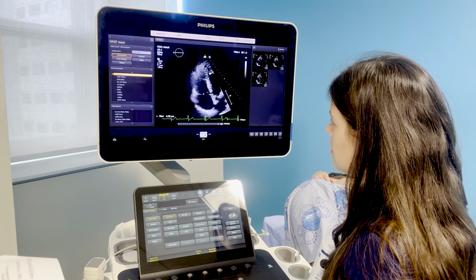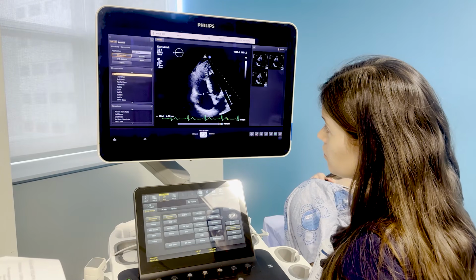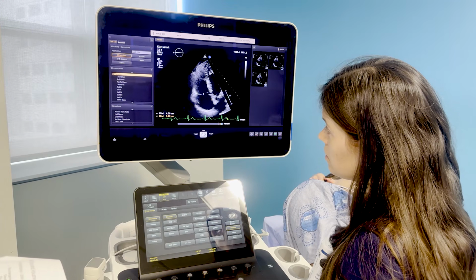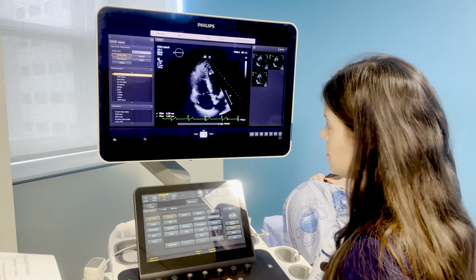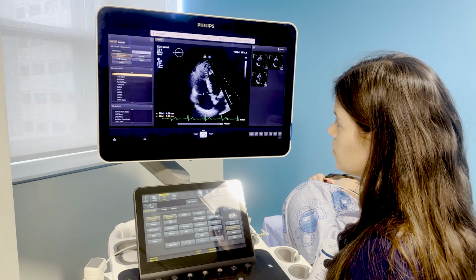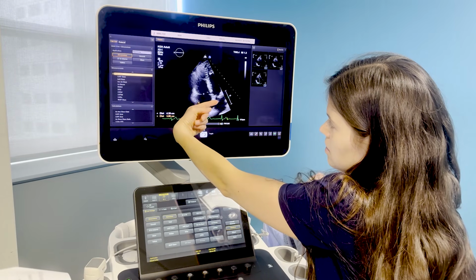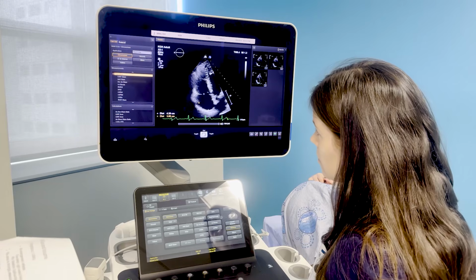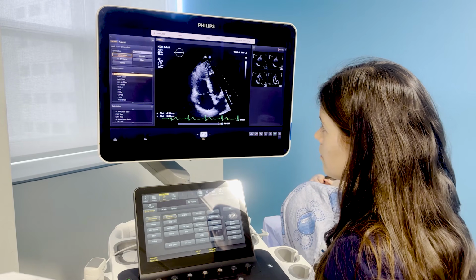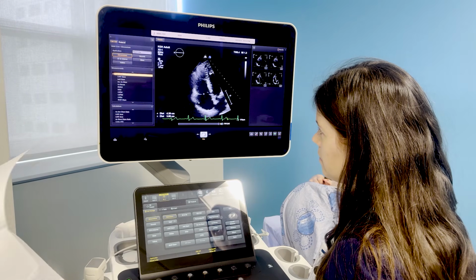Our minor dimension will be from the free wall into the interatrial septum, like that. It doesn't seem to show the actual lines on this one. Okay, look at that afterwards. I'm just kind of drawing a line like this, and then a line like this as well. Okay, great. And you're excluding the right atrial appendage if you see anything like that, and the IVC in case you see anything in that view. Correct. Great. All right. Thank you.